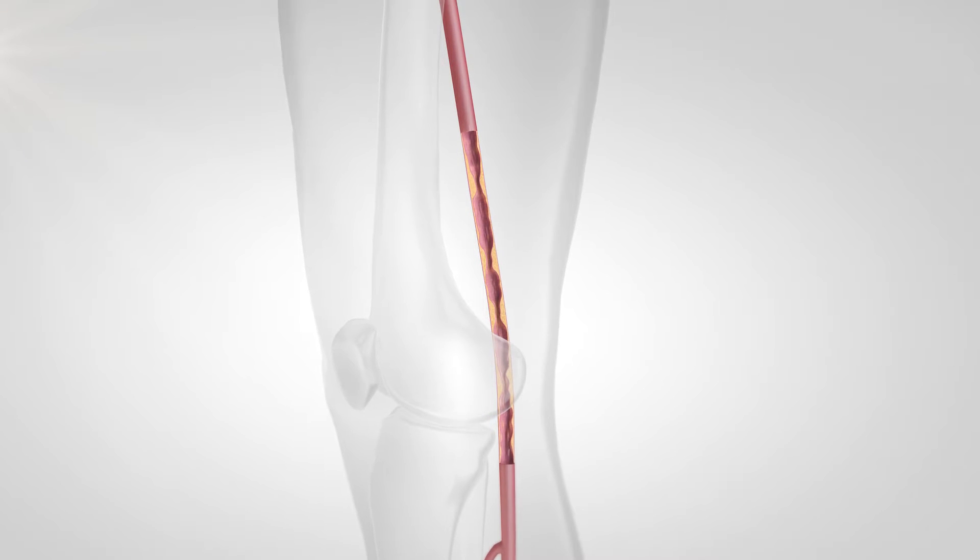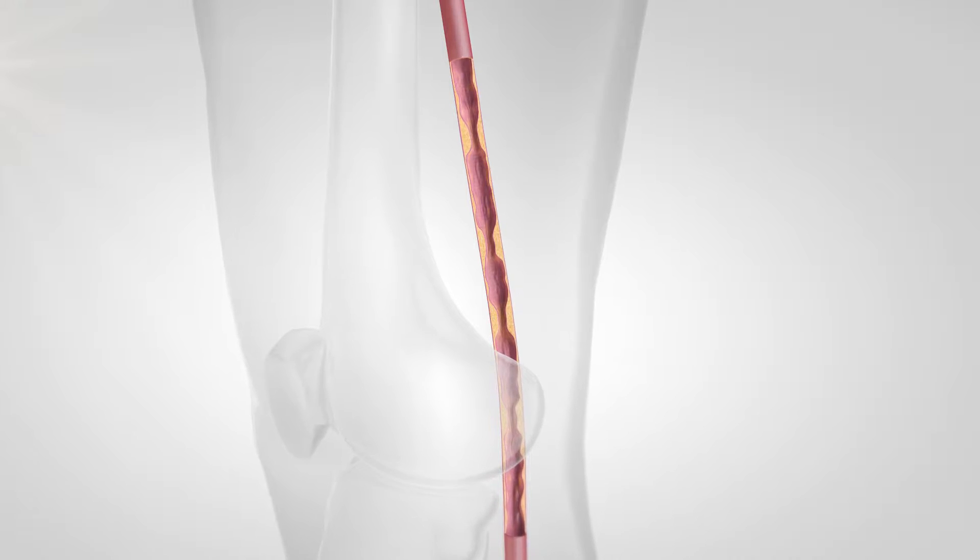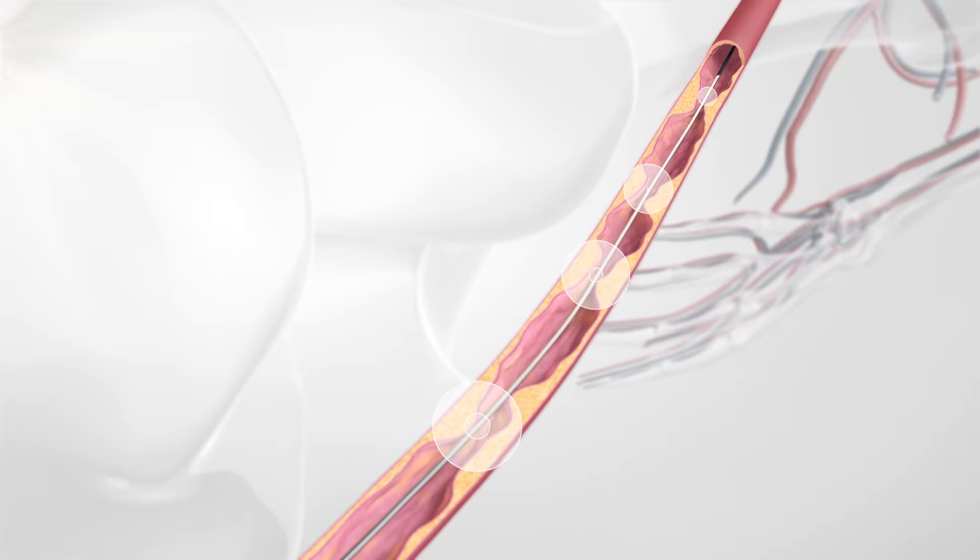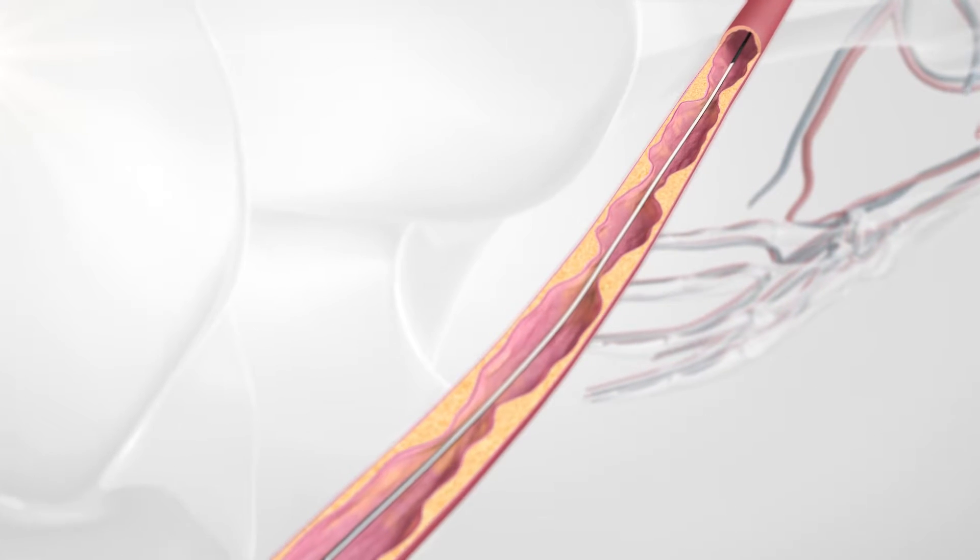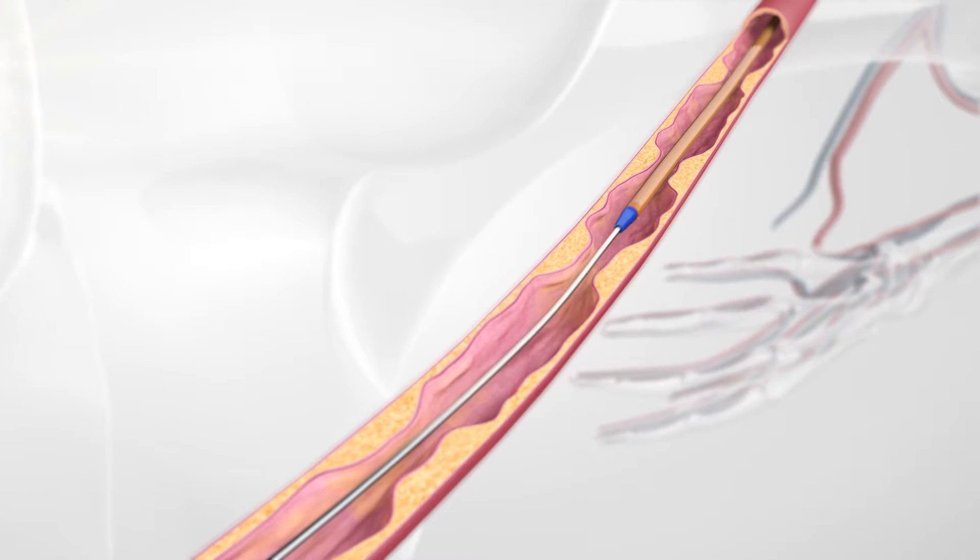In this example, four highly calcified lesions are in a 13cm long segment. After pre-dilatation with a balloon catheter, the first short stent can be implanted.